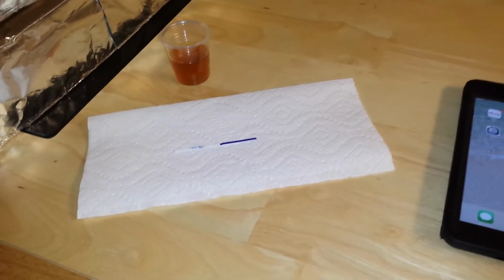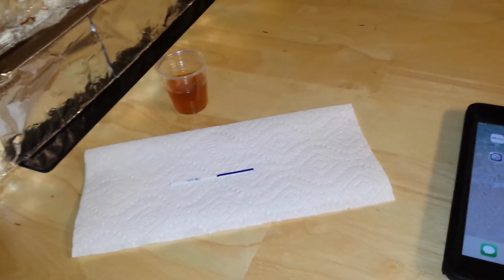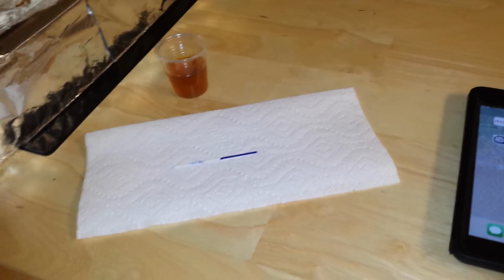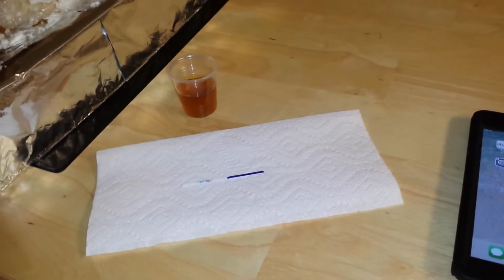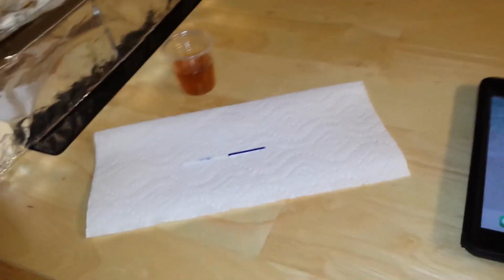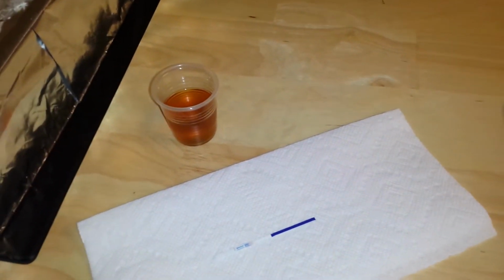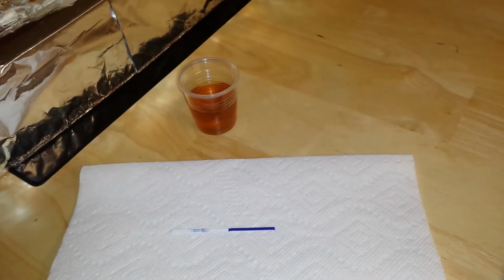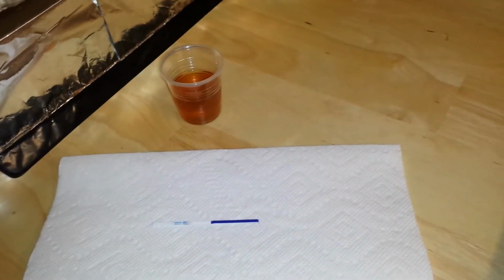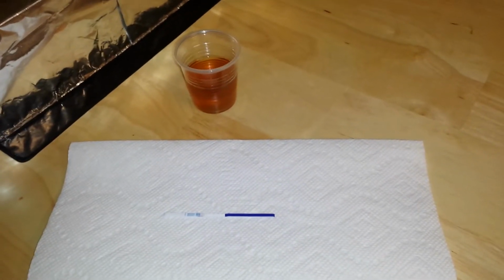Blue dye tests, I highly recommend you stay away from, because they are notorious for dye runs and false positives, because sometimes the dye can run into the test line. That doesn't mean that you're pregnant, it's simply a false positive, and not to be misconstrued with an evaporation line. But with a pink dye test, they're 10 times more reliable, but you have to read them within the allotted time frame, and you have to read the instructions and follow them very carefully.